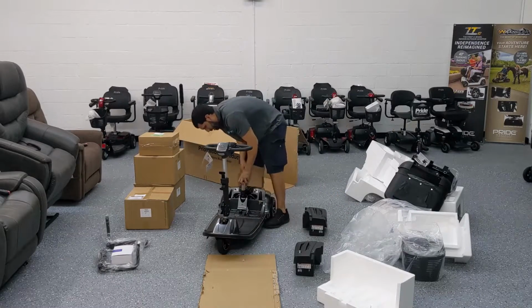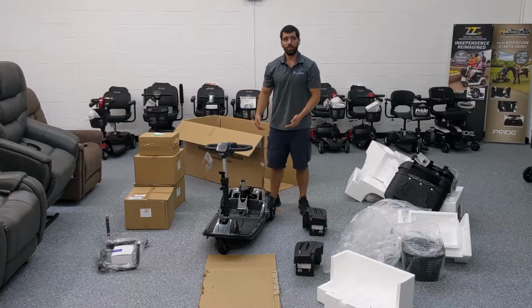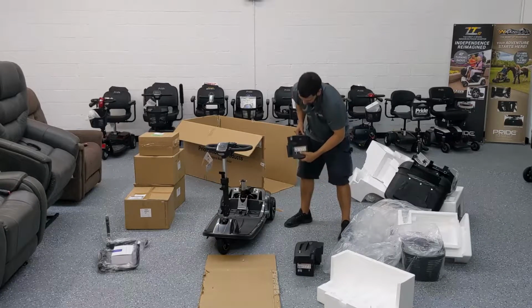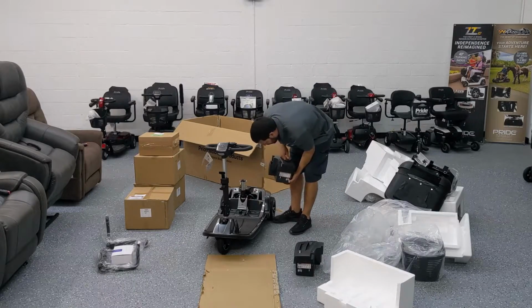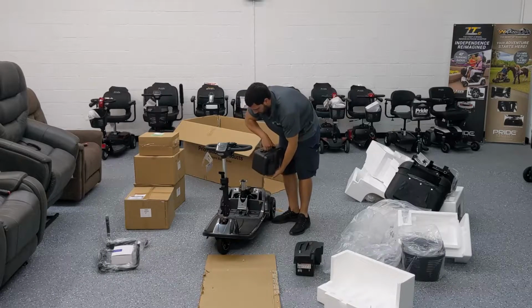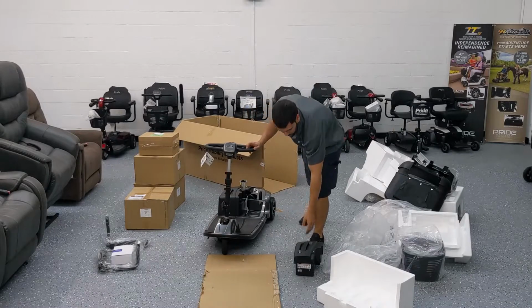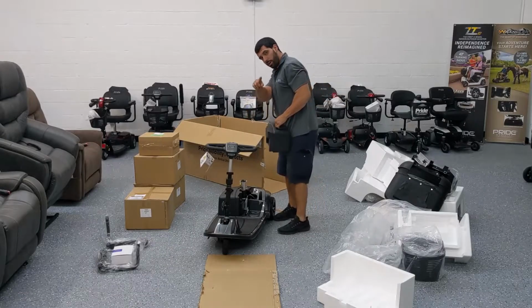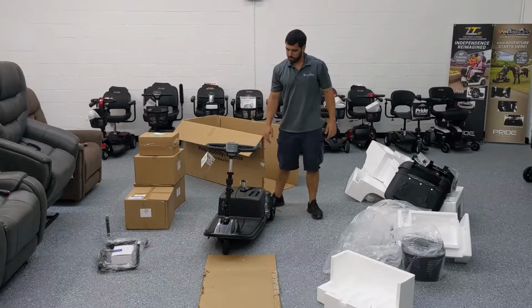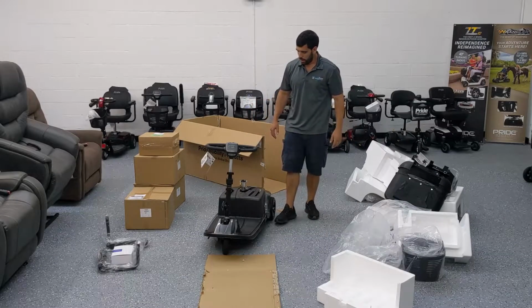Also want to take a note here that the seat post has the ability to go up 1 inch if you wanted to raise the seat to a fixed height that's 1 inch higher than how it comes. You're going to see here on the batteries, they're labeled battery 1, which means it's going to go in on the left side first. Well, if you're looking from the front, it's the left side. If you're sitting on it, it's actually your right side. And then battery number 2 goes on the right side if you're looking at it from the front, left side if you're sitting on it. You do have to follow that order in order for them to fall into place and make that connection. The 2 12-volt batteries make contact and form a 24-volt powered system here.